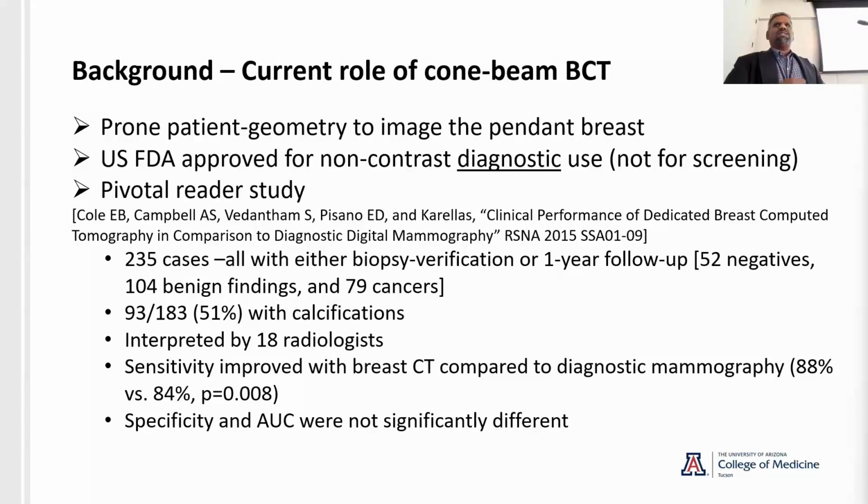On the other hand, once they have had any symptoms, or they had a screen, and either the quality is not good, or they find a suspicious lesion, or the radiologist couldn't make a decision, they call them back, then it's a diagnostic exam. And most of the dosimetry, the dose limits that we talk about, and what's the dose from mammography, it's usually screening. The diagnostic dose could be way higher. So I wanted to highlight that because we are talking about non-contrast diagnostic use.